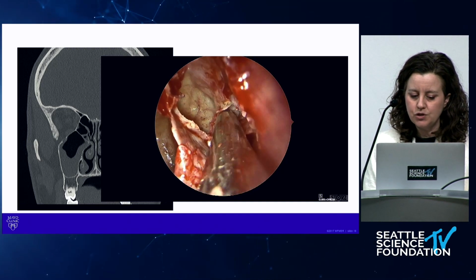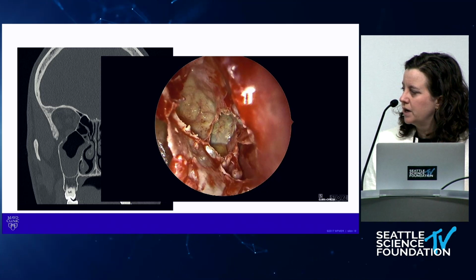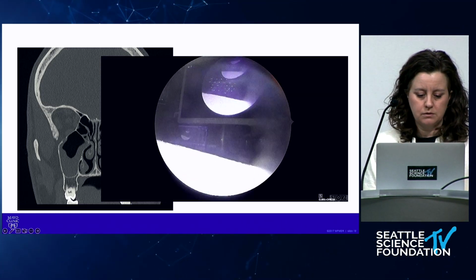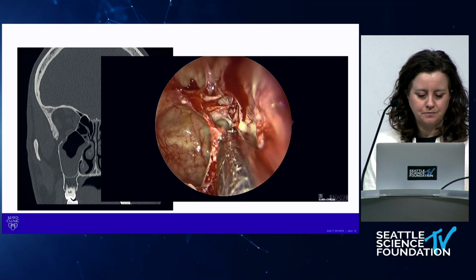I do use navigation. I do like the navigated microdebrider, partly because I have trainees, and so I can see where they're going. But now we've got those posterior ethmoid cells open. So again, it's find the lamina.